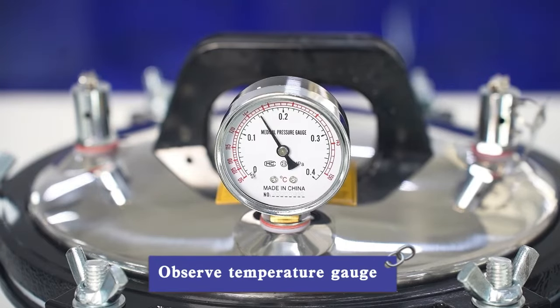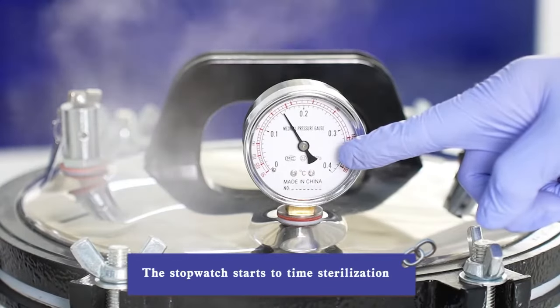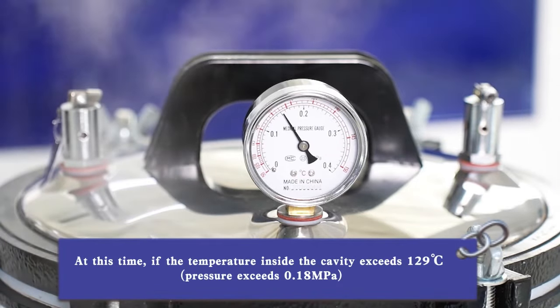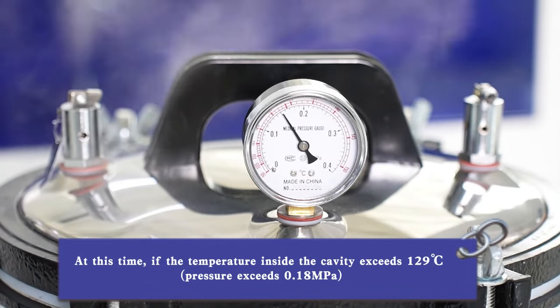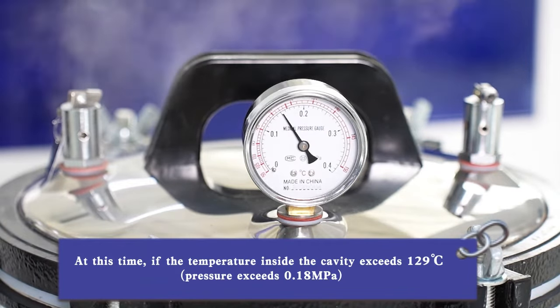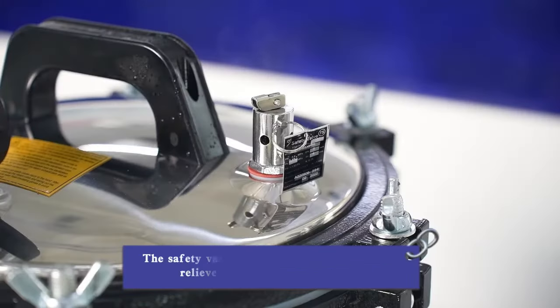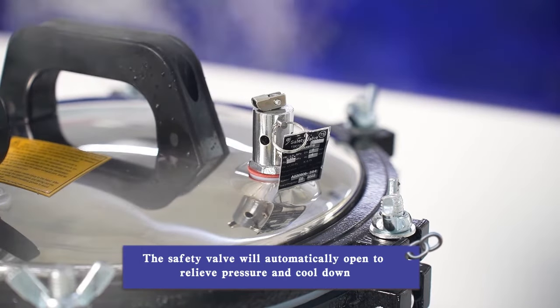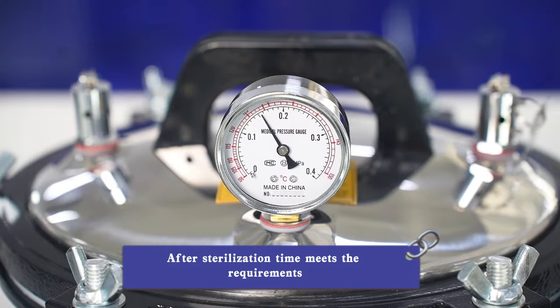Observe the temperature gauge. When the pointer reaches 126 degrees, start the stopwatch to time sterilization. If the temperature inside the cavity exceeds 129 degrees or pressure exceeds 0.18 MPa, the safety valve will automatically open to relieve pressure and cool down. After the sterilization time meets the requirements, proceed to shutdown.